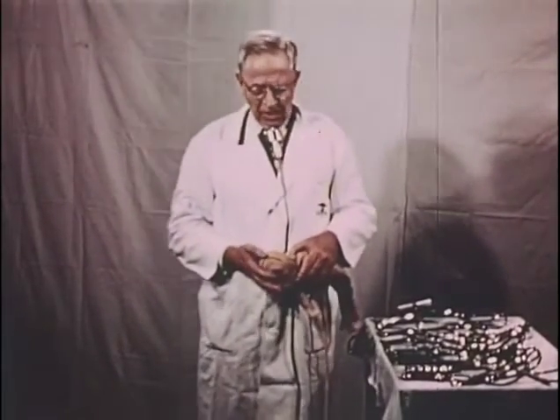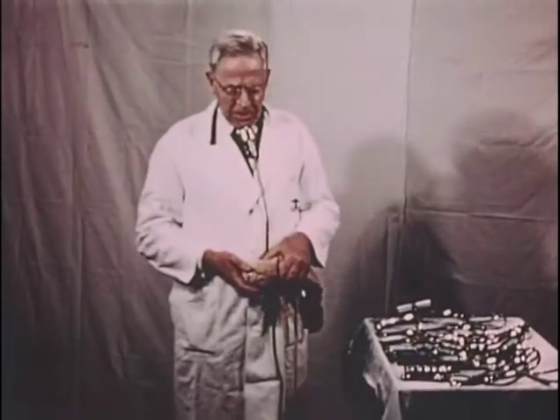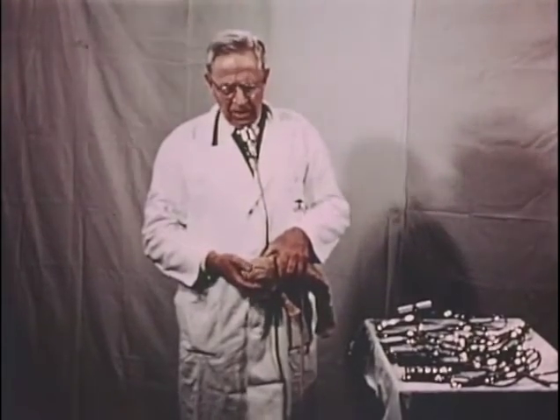Now we'll continue with the technique of the application of forceps. Of course, it's essential that we keep in mind all the prerequisites to a forceps delivery, and having satisfied them, we proceed with the application. An important point is the station of the head.